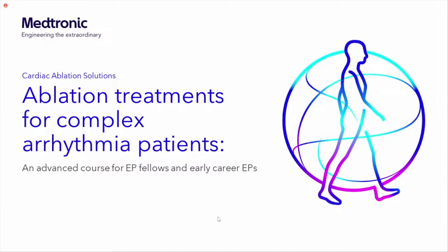But no, I want to make a comment about the cough, because it does happen with RF. The difference is now we are mostly using general anesthesia, but the day that we used to do that under conscious sedation, when you ablate the left superior, you do have people coughing, and some of the patients have chronic cough that lasts for several weeks after. So it's an irritation of the bronchial, so it happened with both energy sources.